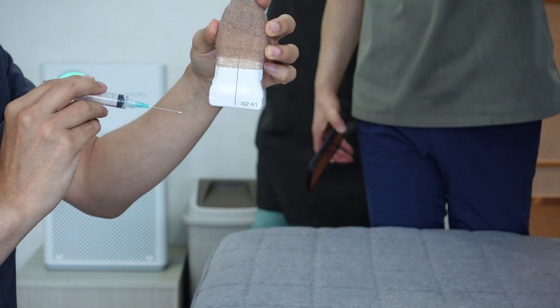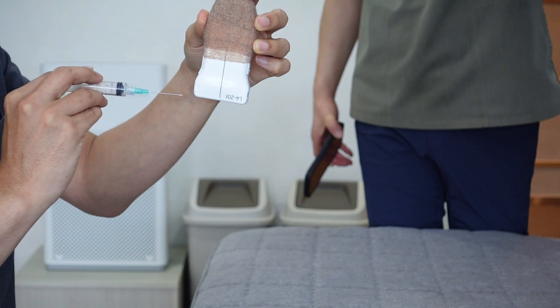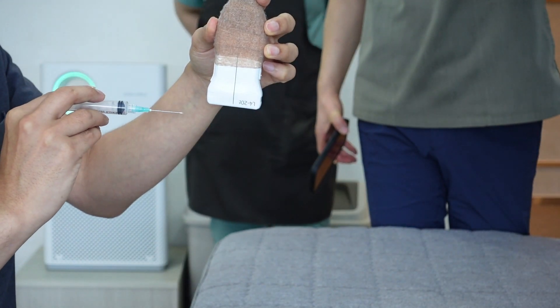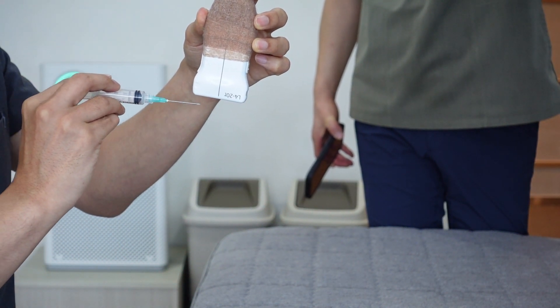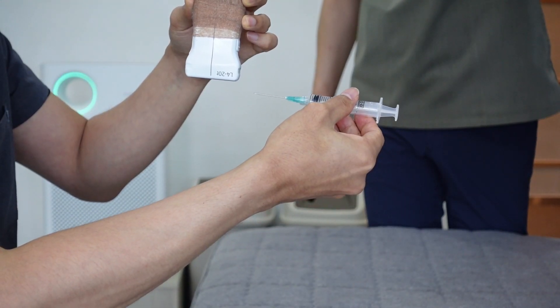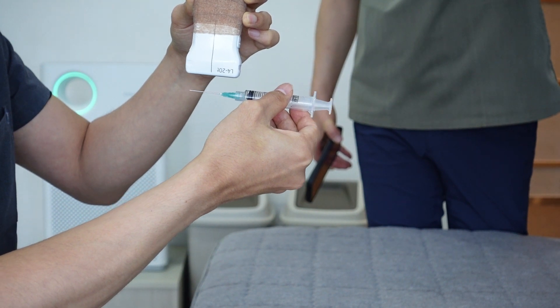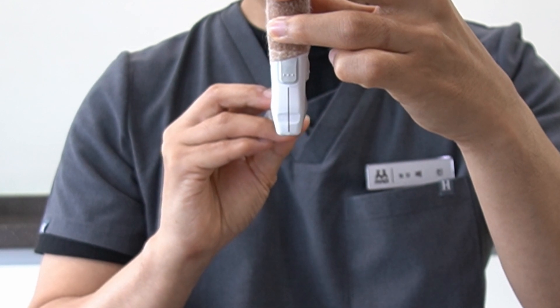Next, let's examine the vertical approach. In this scenario, the needle either recedes from the operator toward the far side or advances from the far side toward the operator. First, the operator holds the probe with their left hand and the needle with their right hand, with the needle moving vertically away from the operator toward the far side. Secondly, with the same hand orientation — probe in the left, needle in the right — the needle moves vertically from the far side to the operator's front. In this clip, the needle appears to be moving toward the viewer, perfectly centered.